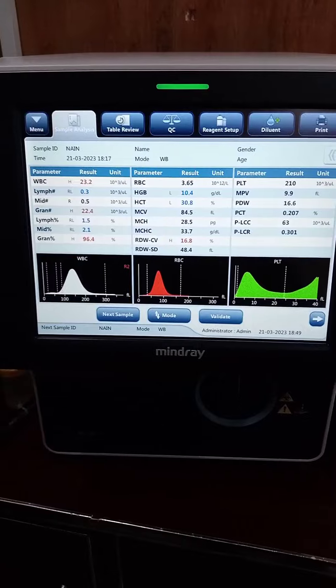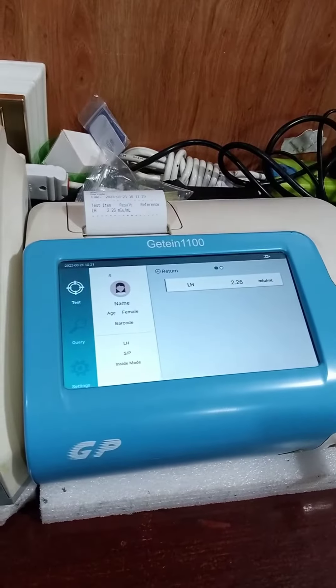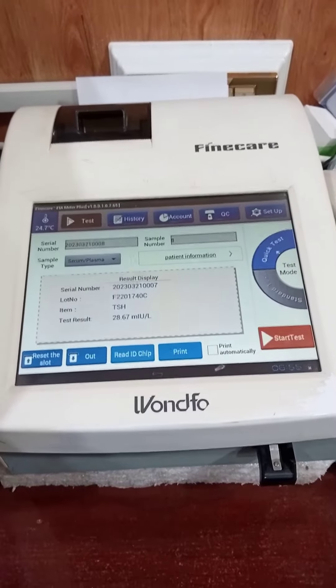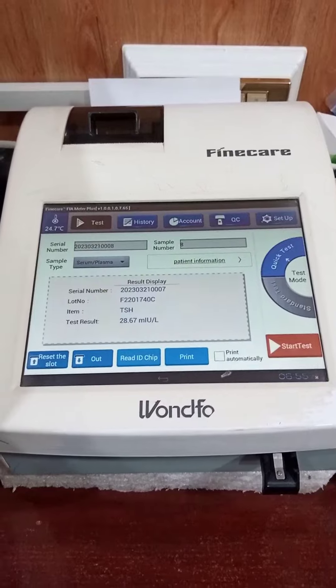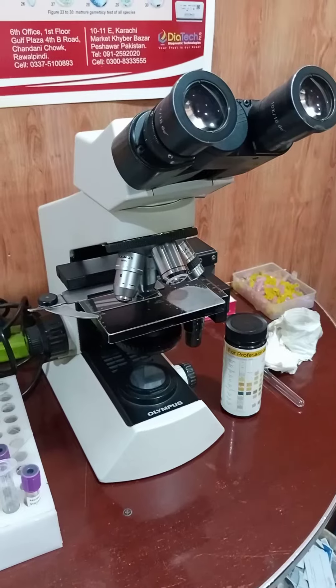The next ones are the Fine Care and Jet 1100. Both machines are used for special testing like hormonal check-ups: luteinizing hormone, FSH, prolactin, TSH, T3, T4, etc. And this is a light microscope where different samples like urine and semen are analyzed.